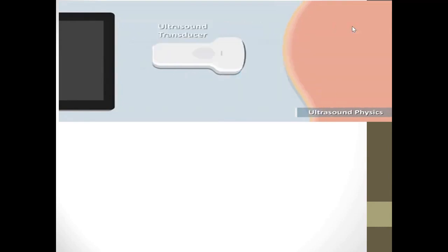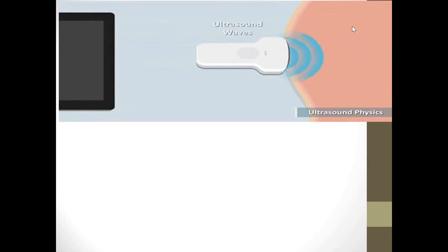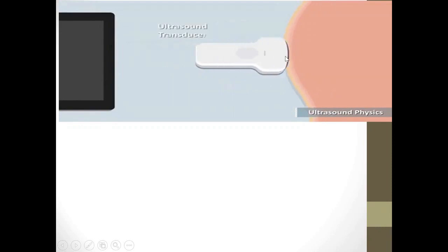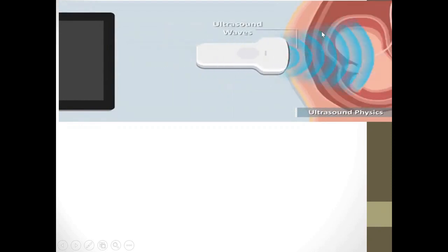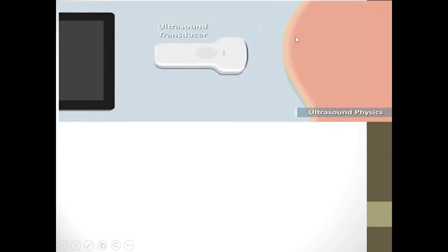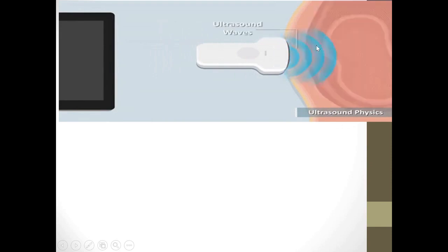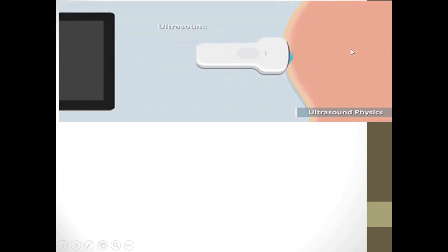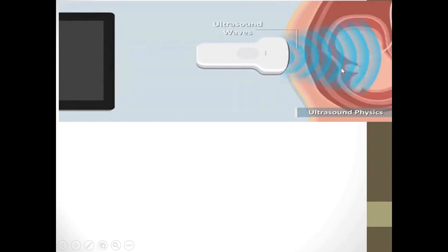Different types of interactions can occur during transmission. For example, the part that is reflected, the part that returns, which I call an echo. Depending on the intensity of a certain signal, the probe starts to record or receive this signal again. You will find that you have a certain pulse, and then the probe will receive this second signal.